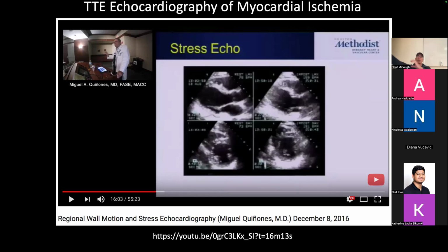And so in a stress test, I start taking echo images. I have in the patient, in their antecubital vein or something, a line, and then I add a little bit of an agent called dobutamine to their blood. And it's like adrenaline. And so their contractility of their heart gets really high. Their heart rate doesn't necessarily get super high, but their contractility gets high. So they squeeze a lot more blood. And it's quite interesting if you're a volunteer in a study and you get this stuff.